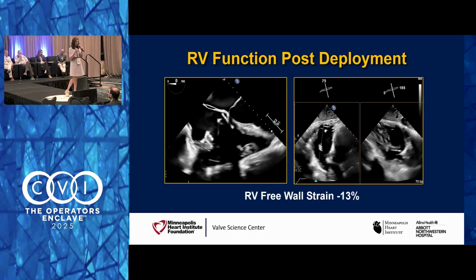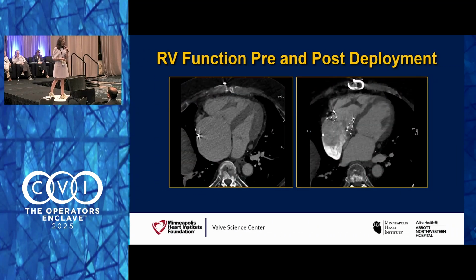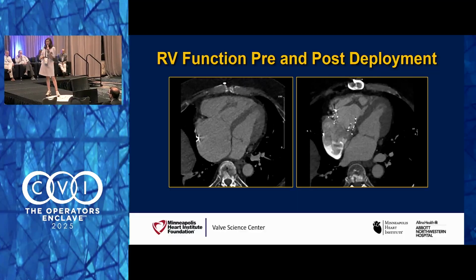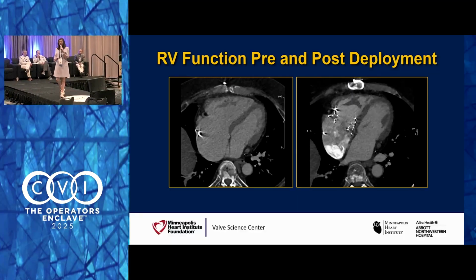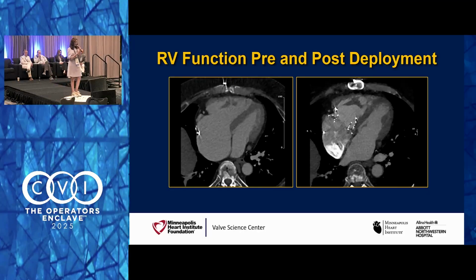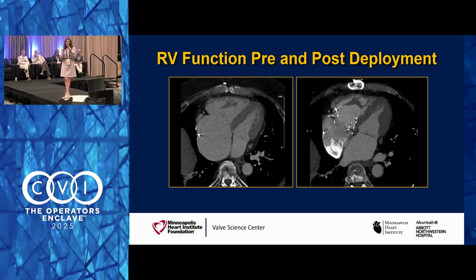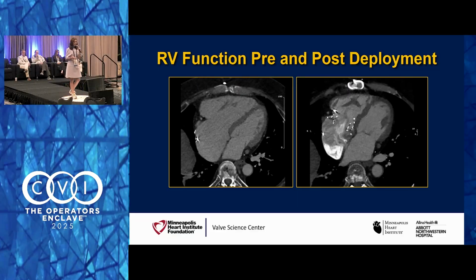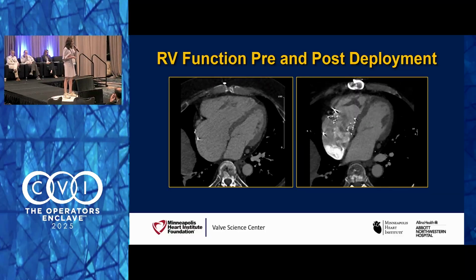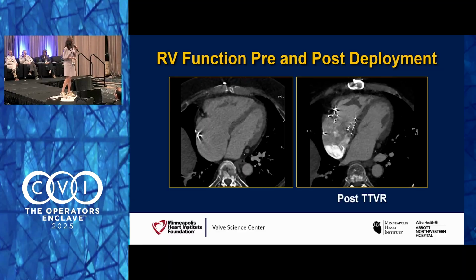And the free wall strain, we do that on echo, it's markedly reduced. We know that, but the patient did well. We extubated the patient, brought the patient up, not even to a unit, to the floor. He was walking the next day. We did a CT before discharge, but look at that septum, to Manny's point. It's moving. And you look at the pre and post deployment on the right-hand side, look at the LV, it's contracting much better. And so this gentleman was discharged after 2 days of hospitalization.